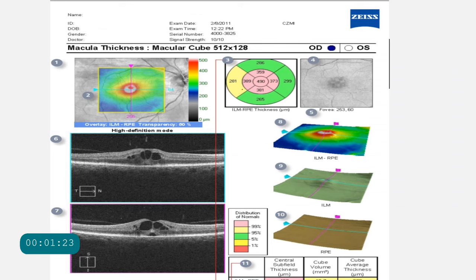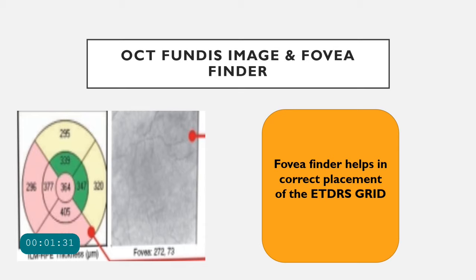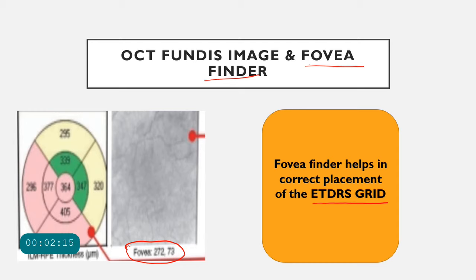After the ETDRS grid, number four on the printout indicates the OCT fundus image. This is a more high-definition image compared to the previous one, where the macular anatomy is more clearly visible. Moreover, we have a fovea finder — an algorithm present in the machine itself — which helps find the exact location of the fovea for the proper placement of the ETDRS grid. The ETDRS grid must be precisely centered on the fovea, and for that, the fovea finder algorithm is already present in the Cirrus OCT.